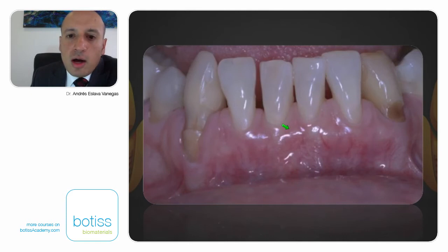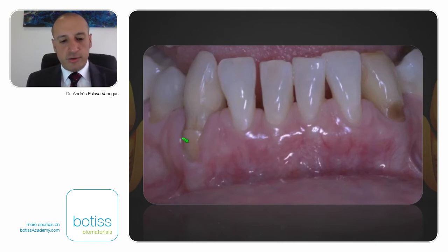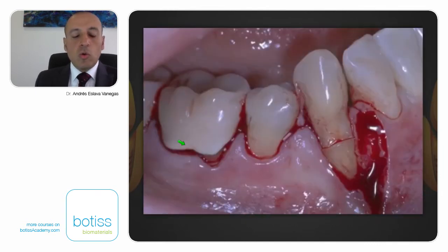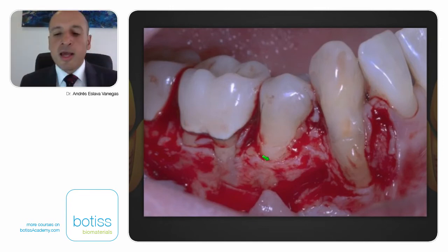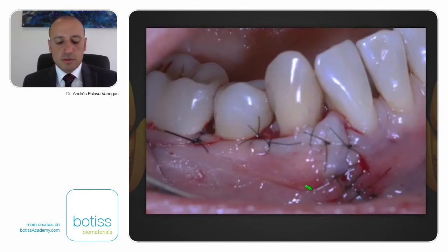So let's make our life more difficult, and as we were gaining more experience, Anna came to us. She was a lady of about 60 to 70 years old, and she wanted us to cover this canine like you see in here. Okay, can you see the biotype? Can you see the gingival recession? So what we want to do is a lateral slide flap, and we want to use, of course, dermal matrix. Okay, we polish our root surface, just burrs. We don't use EDTA or Emdogain or anything different from burrs and growth factors. We put our dermal matrix. We use growth factors and suture, an easy surgery.